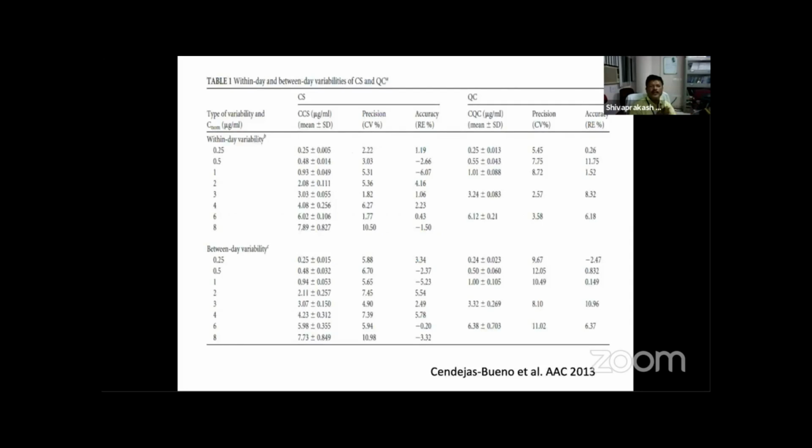EQAS program also. In particular, we found that the correlation between bioassay and HPLC is 0.9994. So it is really very, very good. If you use these particular media, that is RPMI, and the methods that I told you, the bioassay method is reproducible and correlated well with the HPLC method. And when the dose of voriconazole was increased in 2 patients based upon our bioassay report, reduced in 3 patients, and 5 patients were found to have optimum drug concentration for improved clinical outcome.